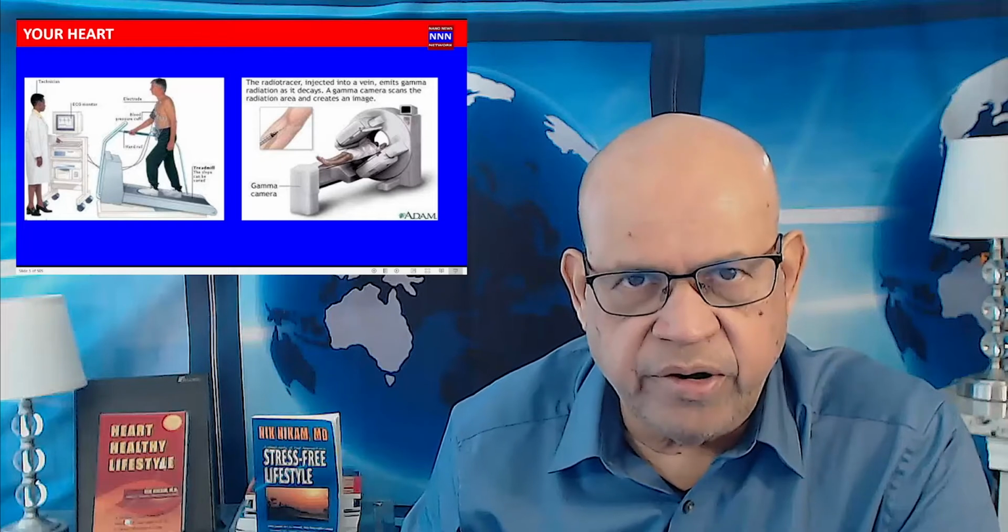As I told you at the beginning, it consists of two components: the complete stress test along with the monitoring of your heart rate, rhythm, EKG, blood pressure, and your vital signs. That is followed by injection of the isotope and taking heart images.